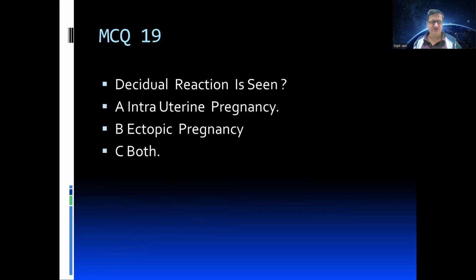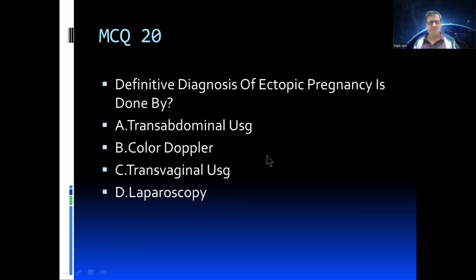Decidual reaction is seen in intrauterine pregnancy, ectopic pregnancy, or both. So decidual reaction will be present irrespective of the location of the pregnancy. So it is present in both ectopic as well as intrauterine.